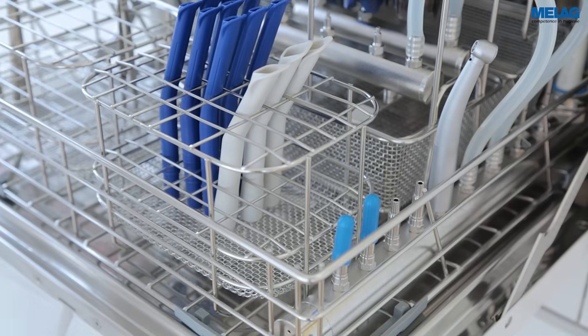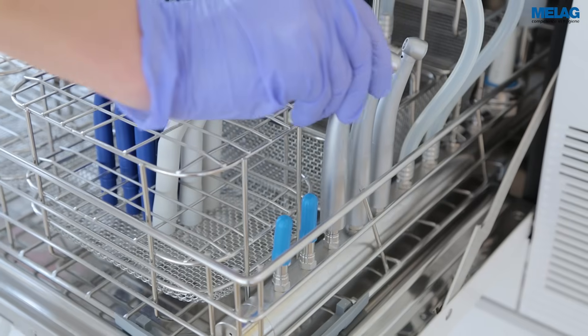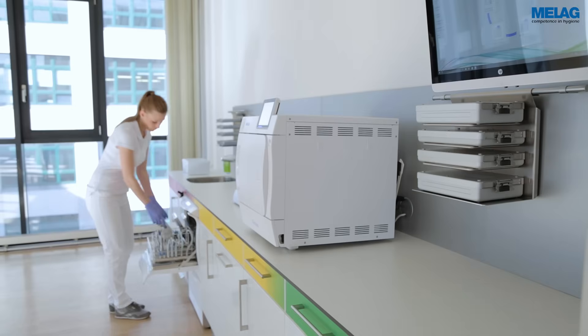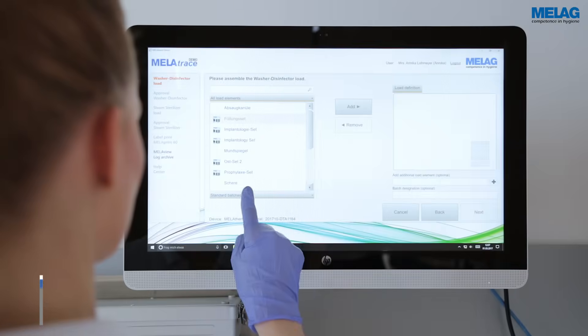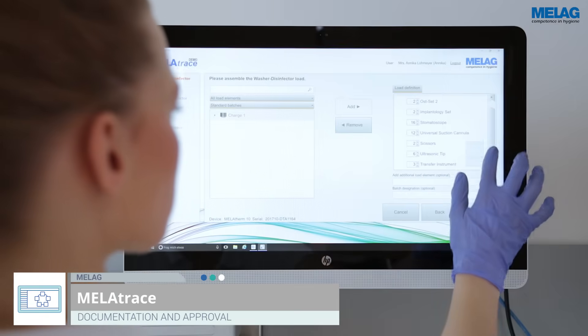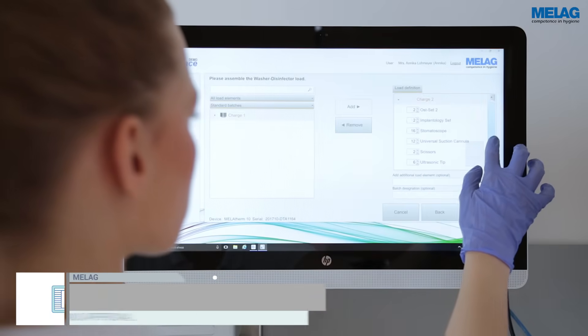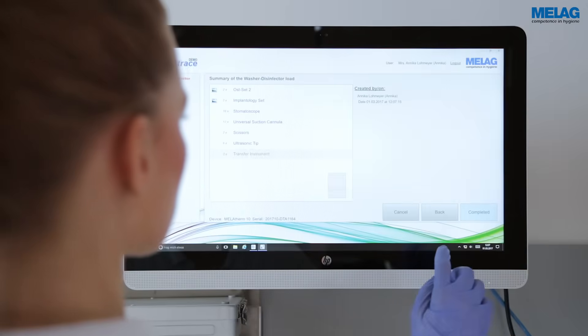An ever greater importance in the treatment process is placed on standardised decontamination of hollow instruments. The use of the intuitive and clearly arranged documentation and approval software MeLaTrace allows complete transparency. Defined load elements of the MeLag Therm 10 batch can be clearly attributed to a later approval.